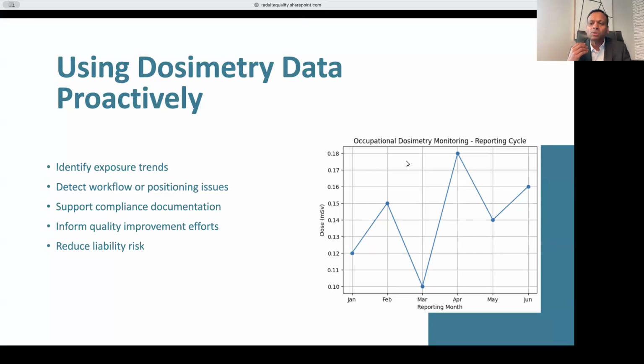So to know the trending for the employees, and just the way Chris put it out there, we have our own internal thresholds. And if anybody is trending towards that, and if it is going higher, more than anything, this is going to give you the radiation safety behavior and the workload for that individual. Yes, there is an indirect way of knowing if that particular equipment is giving a higher dose. I would usually go with a more direct way of measuring it rather than relying on this piece of data. I will use this data, but as supplemental data. You know what I mean?